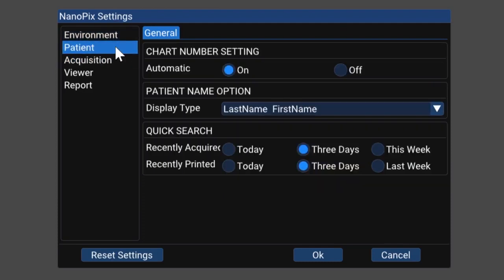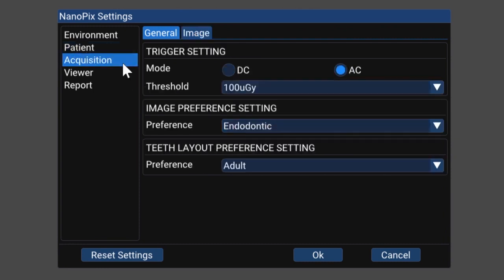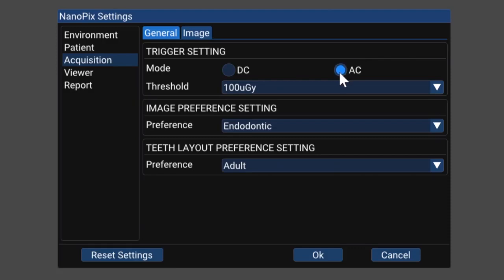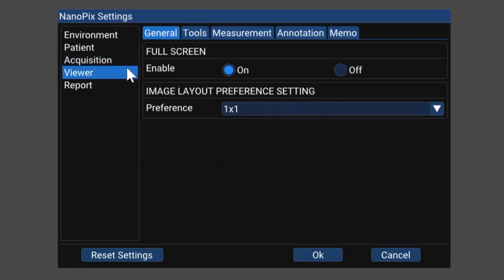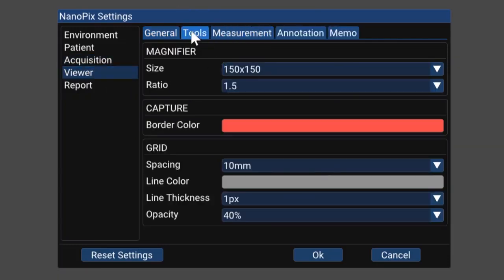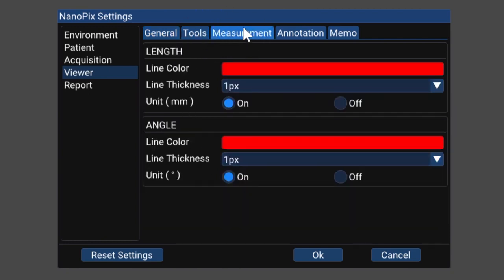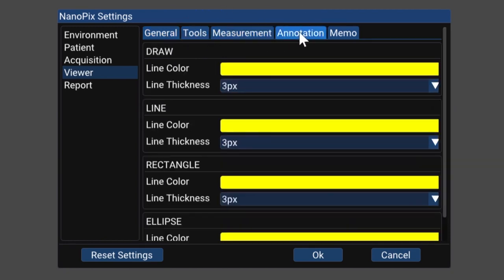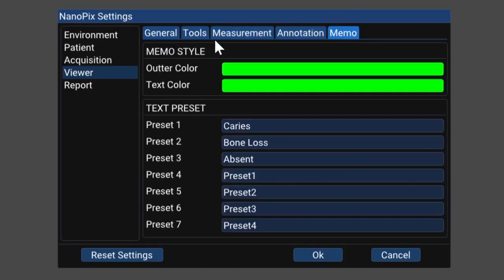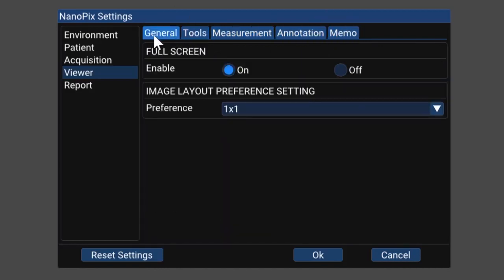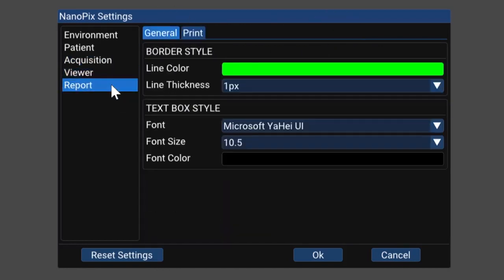Under patient we can also do chart numbering. You can set up how you want the patient to be named. Under acquisition you can set up specific for your x-ray unit. For me I needed to set it to AC and we have a threshold set for a hundred micro grays. In the viewer there's a whole bunch of different tools that you can use under your magnifier and you can really adjust and customize the way that you want your software to run for you. And then under report really customize the way we want to use this.